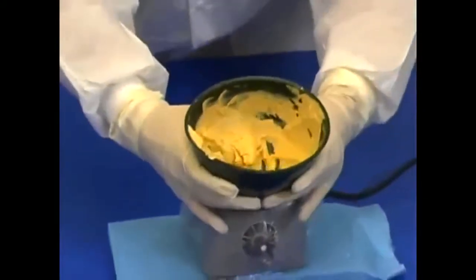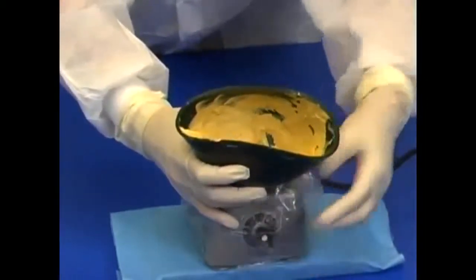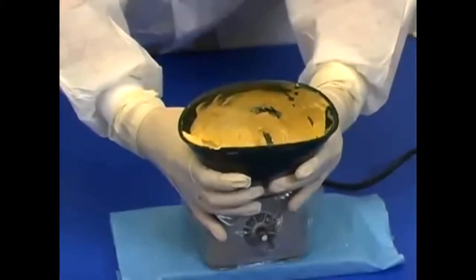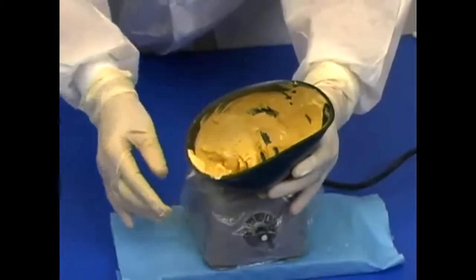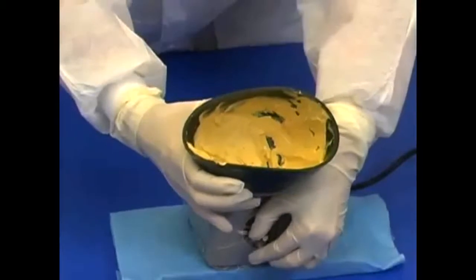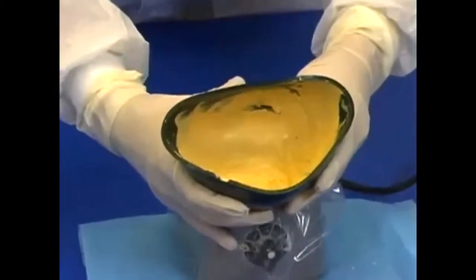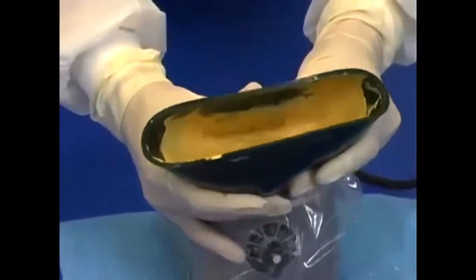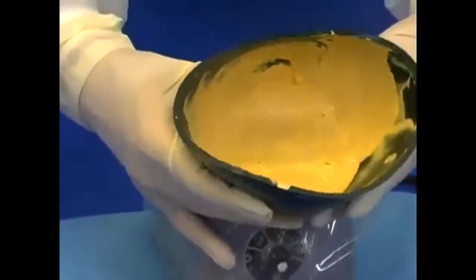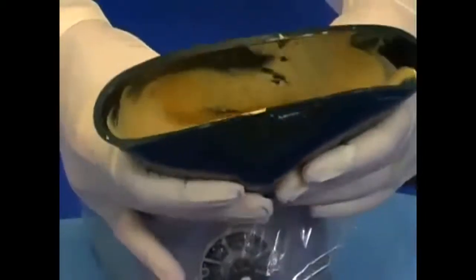Turn the vibrator on low and place the bowl on the work surface. Covering the vibrator with a plastic bag will make for easier cleanup. Press the bowl downwards onto the vibrator and press the sides of the bowl inward with your hands. This will remove all air incorporated during the mixing procedure.